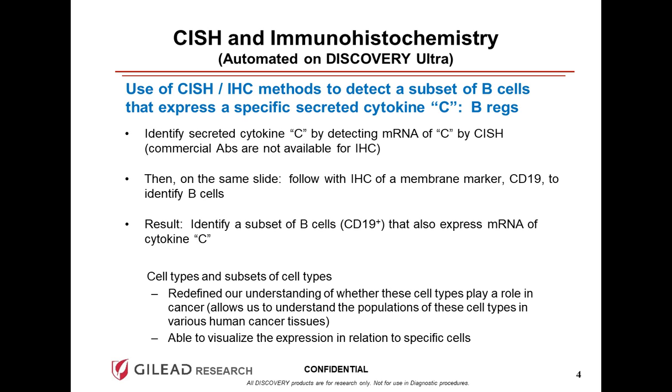Detecting cytokines with immunohistochemistry can be limiting, as cytokines are poorly quantitative, and actually they're very hard to detect since they are secreted proteins. And that's been an ongoing theme in my lab when trying to detect any secreted protein or secreted matrix enzymes. So we need to find a way to detect the localization of the cytokine of interest.